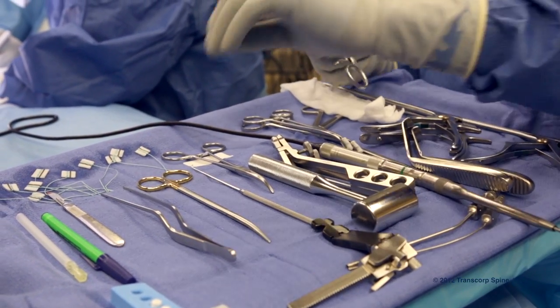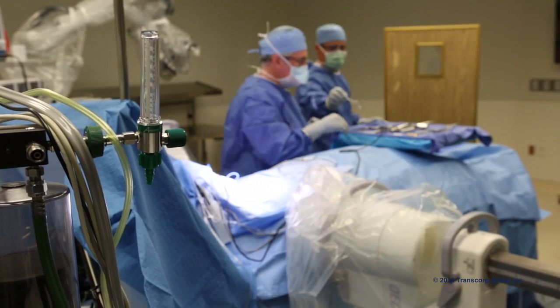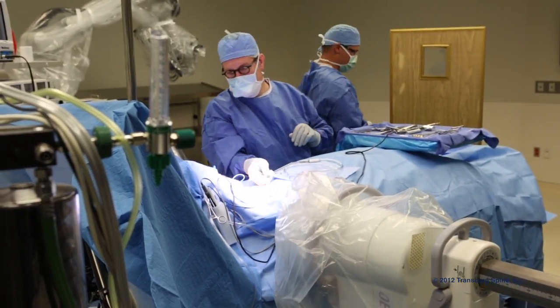As a surgical tech, learning the procedure came pretty natural and pretty easy. There's one instrument pan that you use and it comes very well organized, and the steps just kind of progress naturally.